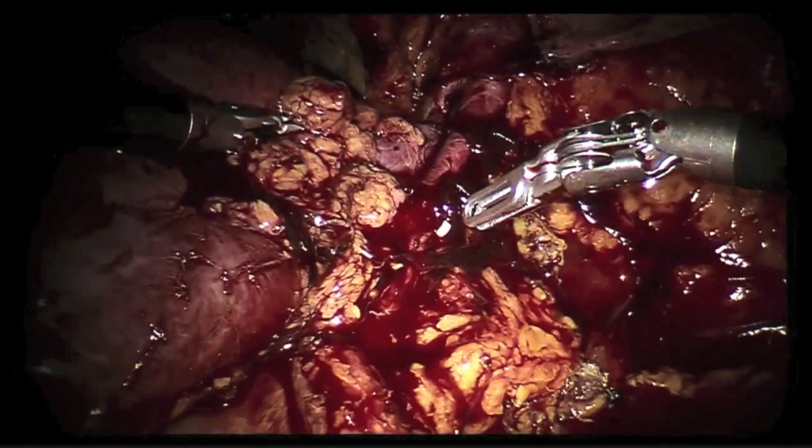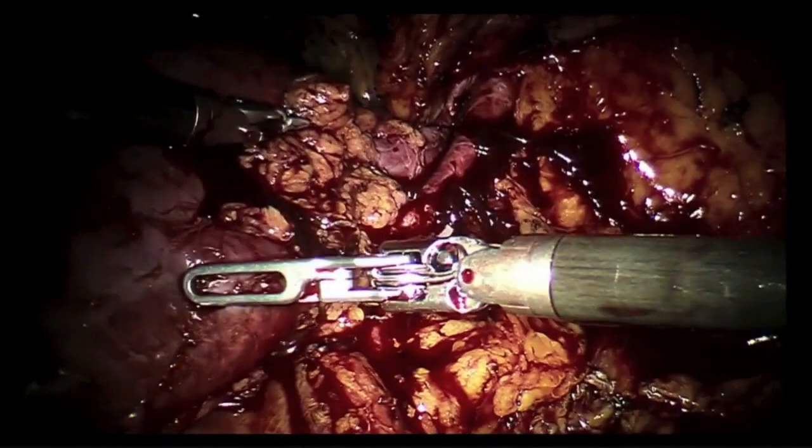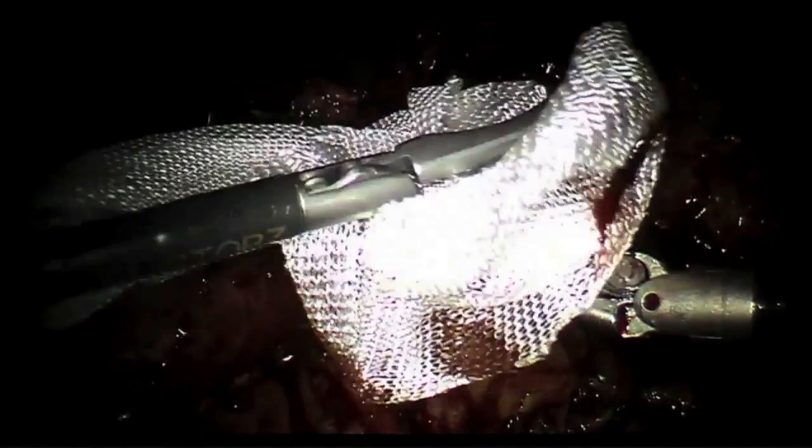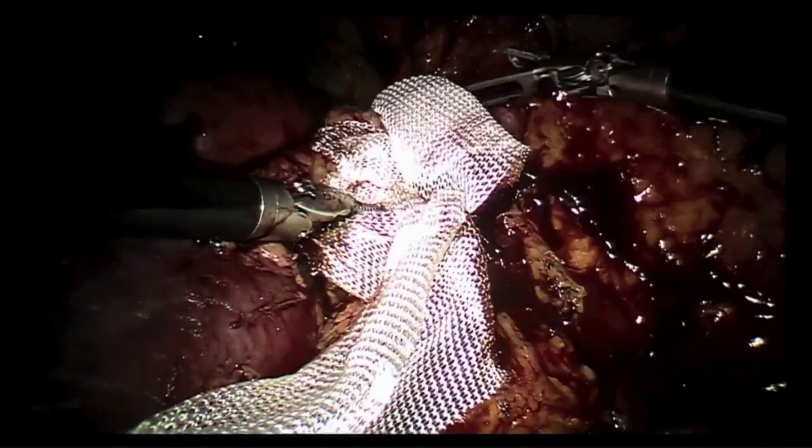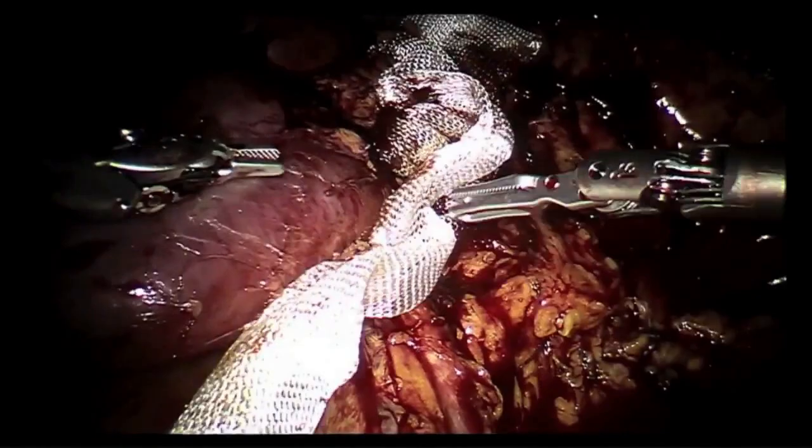Both vein and artery look good, kidney looks good, it really feels good. The feeling is excellent. It is not overly tense. It is not soft. It is normal. And if we have an ultrasound, we can do the resistive index. Let go. I think it'll open up here in short order. And it's globally perfused.